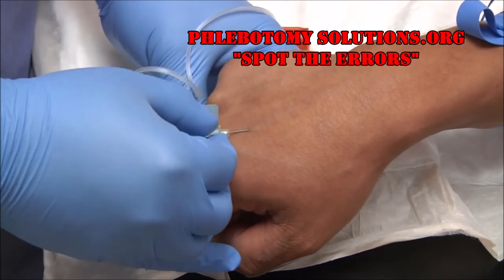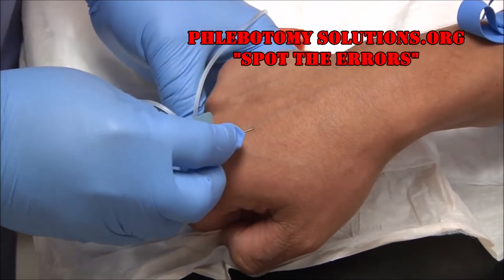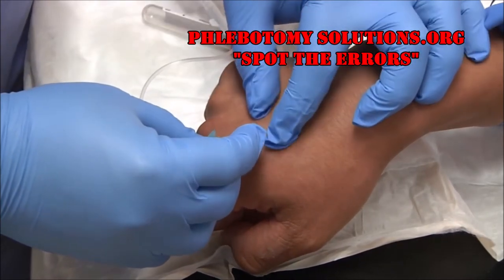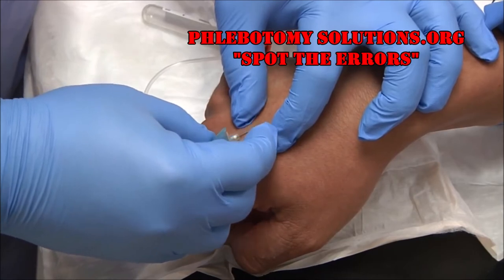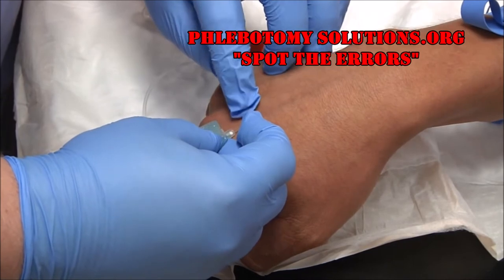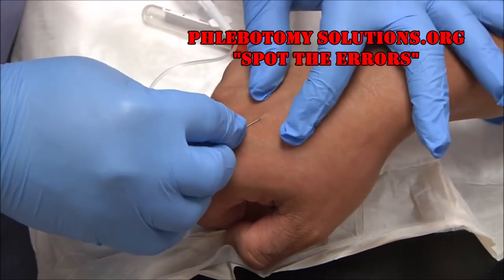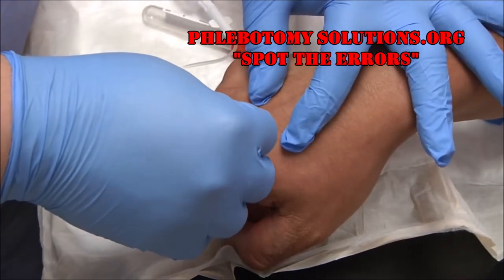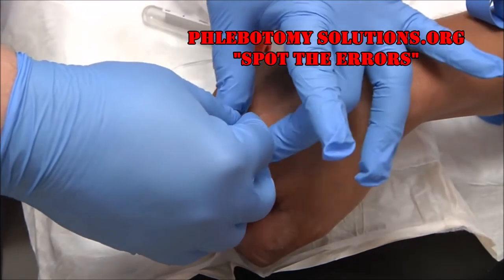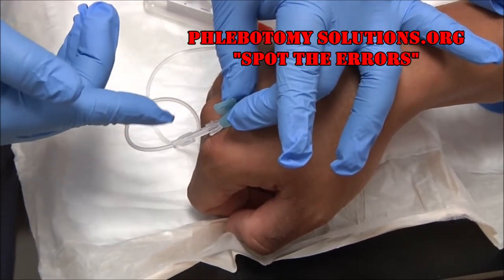One, two, and insert. One of the good things about the butterfly or winged collection set is you will see a flash of blood in the tubing when you've hit the vein. Sometimes you need to readjust your needle. There is my blood flash — you can see a little flash of blood in the tubing.